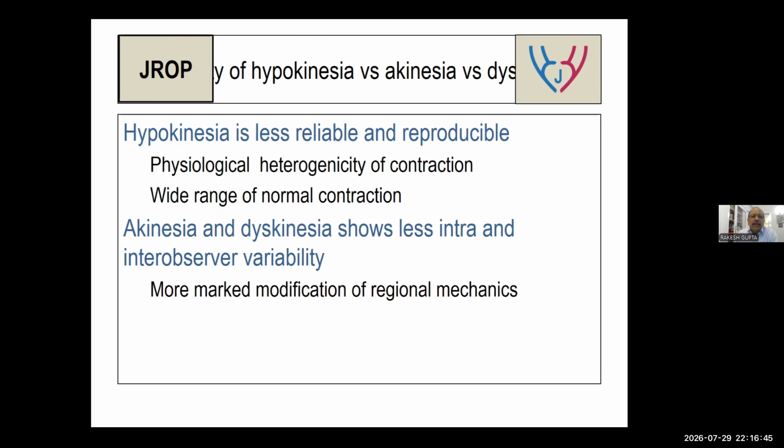Dr. Surbi, online 8. Good evening, sir. Sir, I want to ask how to calculate the wall motion score index in a patient with regional wall motion abnormality. Let's do it right now for you.